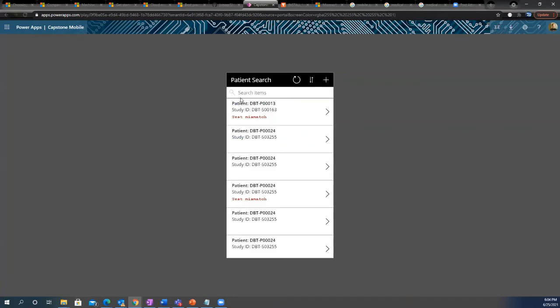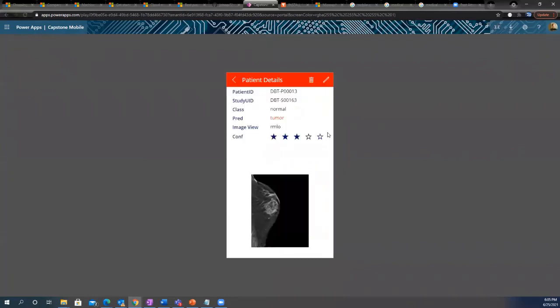Now let's look at patient 13. Right away, the doctor can notice two visual cues to call to his attention. Firstly is the one we mentioned, the mismatch right here. But secondly, notice there is only one listing for patient 13 present. And recall, we mentioned earlier, each patient by default should have 4 different views. So it's possible other views needed to be discarded because they weren't associated with a biopsy result. And having 1 in 4 views could certainly affect the model's precision. So the doctor goes and investigates.